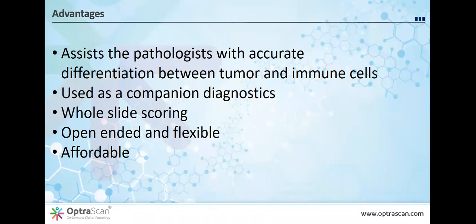And then the algorithm on a training set was tuned to match those scores as closely as possible. Once the training set had been used to train or calibrate the algorithm, then the algorithm was turned on to a test set of cases, again, that had been consensus scored. And that was where the algorithm was evaluated as to how accurate it was versus consensus diagnosis and versus individual pathologists. So we have to be upfront about it.